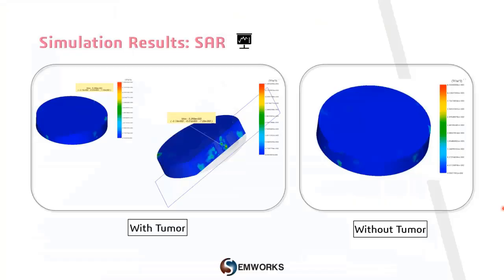The study of this antenna is based on the electric field intensity and SAR results. SAR, or specific absorption rate, presents a measure of the rate at which energy is absorbed per unit mass by human body when exposed to an RF electromagnetic field.